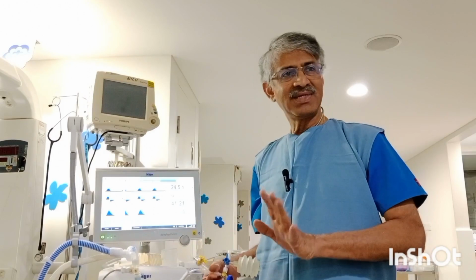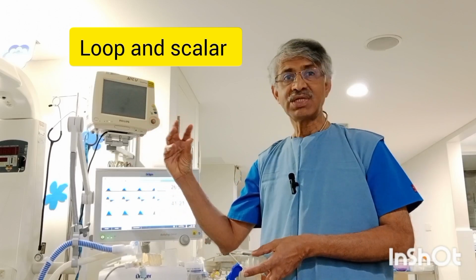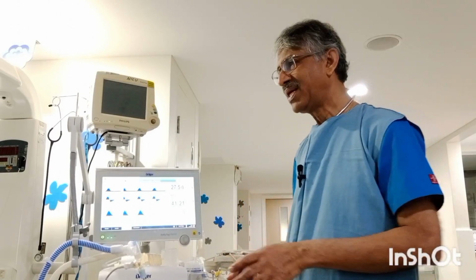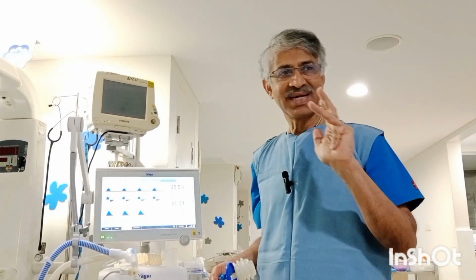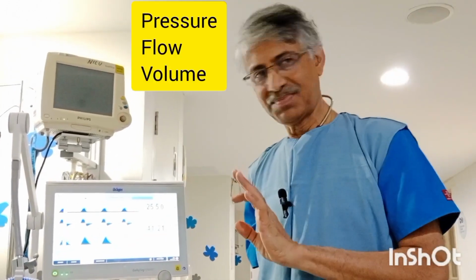Pulmonary graphics is divided into two important portions: loop graphics, which are also called closed curve graphics, and the other one is scalar graphics, also called open curves. We all know that for anything to happen, three important parameters are needed. Pressure is required, correct? Second, flow is required. Third is the volume.